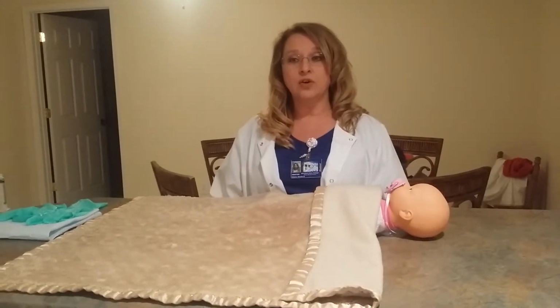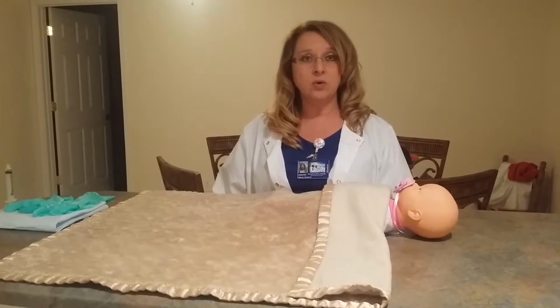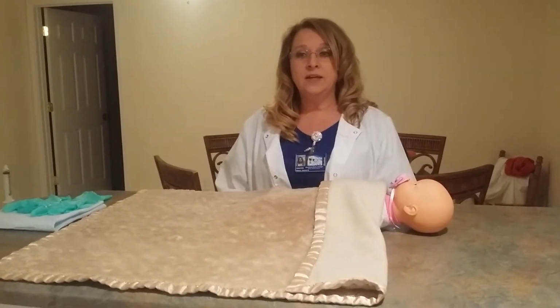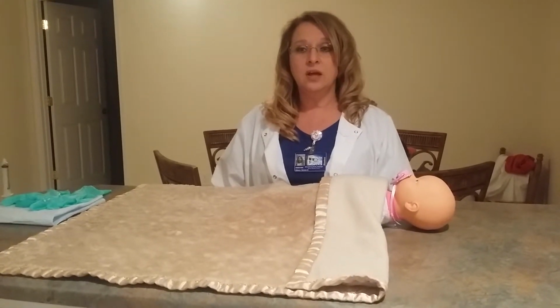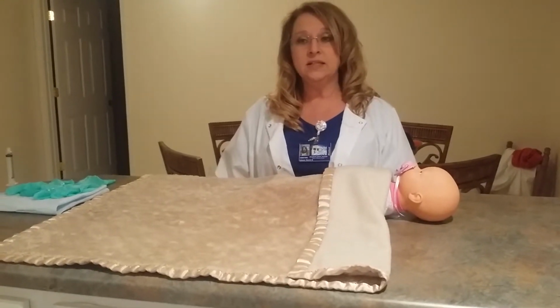An indwelling urinary, also known as Foley catheter, should be removed when bladder decompression is no longer necessary, when the patient can resume voiding on their own, such as 48 hours post-surgical, or when the catheter is obstructed. The need for the catheter should be reviewed daily by the nurse and the physician and removed as soon as need for its use can no longer be clinically indicated.